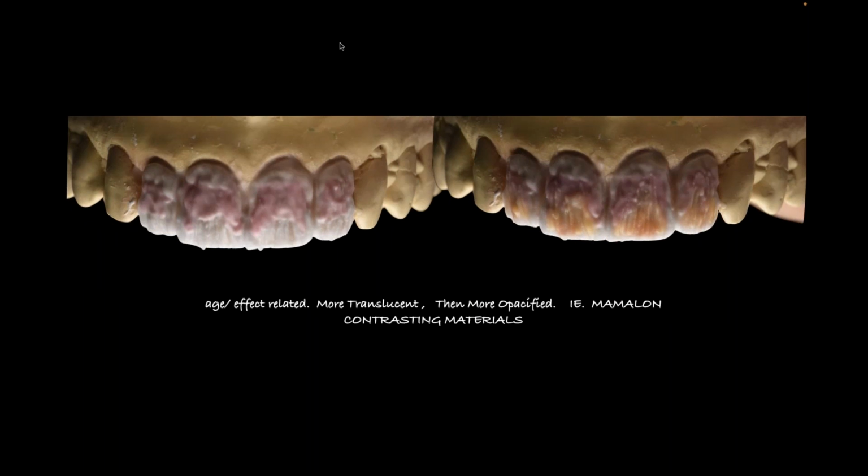So my mamelons are placed. In this case, I might have used 2 or 3 different mamelon materials, but that's kind of standard for me. You don't always have to use that many. I don't like to scare people and think you can't build a tooth without 9,000 powders. Not true. I would also argue you can't build them with 1 or 2. You've got to find that middle ground of 3, 4, 5, 6, kind of a concept that you're adding those second in. But the real importance of that is you need to know why you're adding those powders in and what you're using them for.